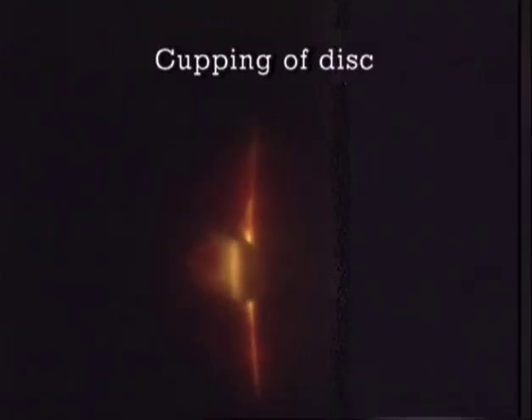At the disc, the narrow light slit permits the evaluation of the cupping, as shown here in a case of glaucoma. The narrow light slit, which is straight over the retina, becomes deeply recessed at the cupping of the disc, and thus demonstrates its depth.